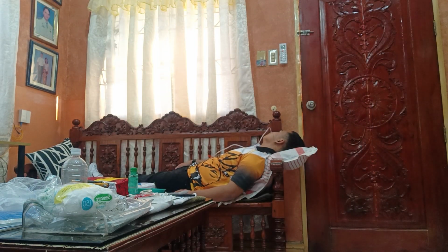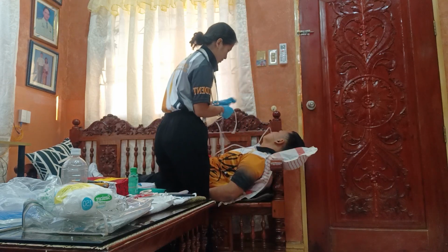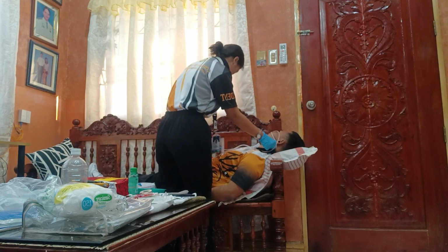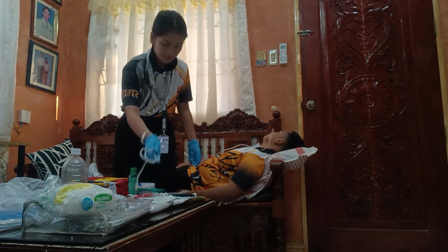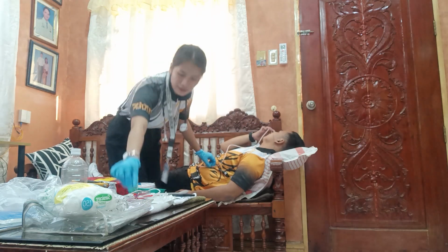Okay, sir. Tapos isi-secure natin sa gilid po ng gown ni patient using the rubber band.